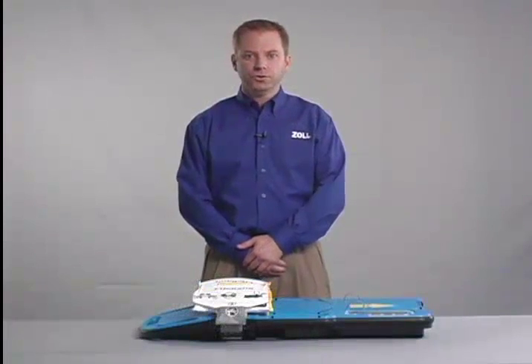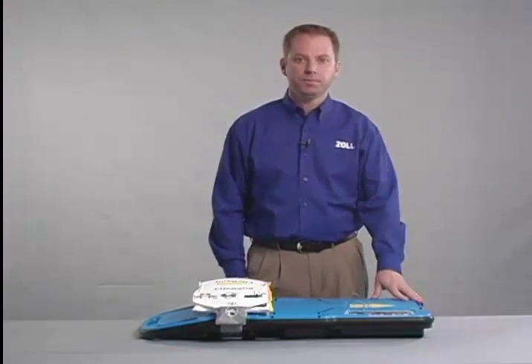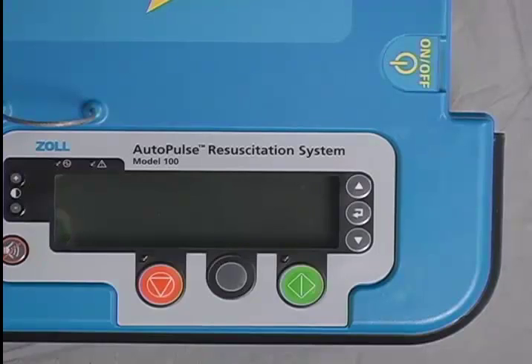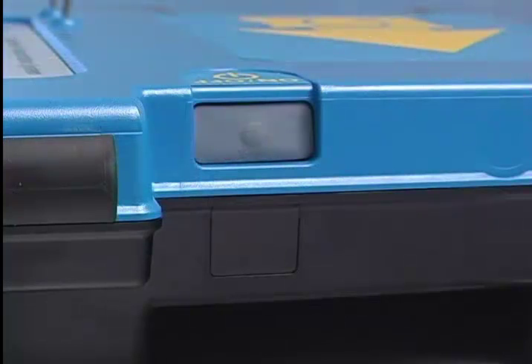Let's take a closer look at the key features of the Autopulse platform. At the head end of the board is the on-off button. The on-off button is recessed and set away from the user control panel to minimize the risk of inadvertently turning the device off.